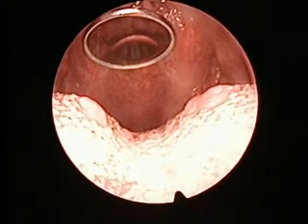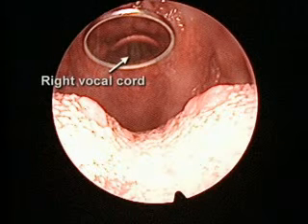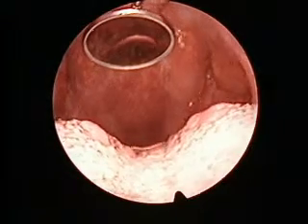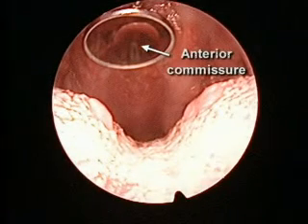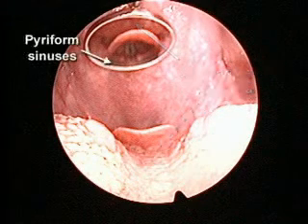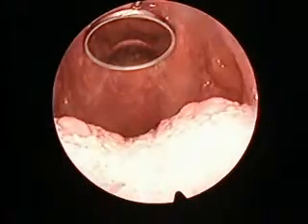E. With mirror laryngoscopy, the image is inverted. In other words, the right vocal cord appears on the left side of the examiner's view on the mirror, and vice versa. The anterior aspect of the larynx can be seen by asking the patient to say E in an even higher register. This fully visualizes the anterior commissure. The oropharyngeal vallecula and the piriform sinuses in the hypopharynx are also visualized and should be inspected for symmetry.